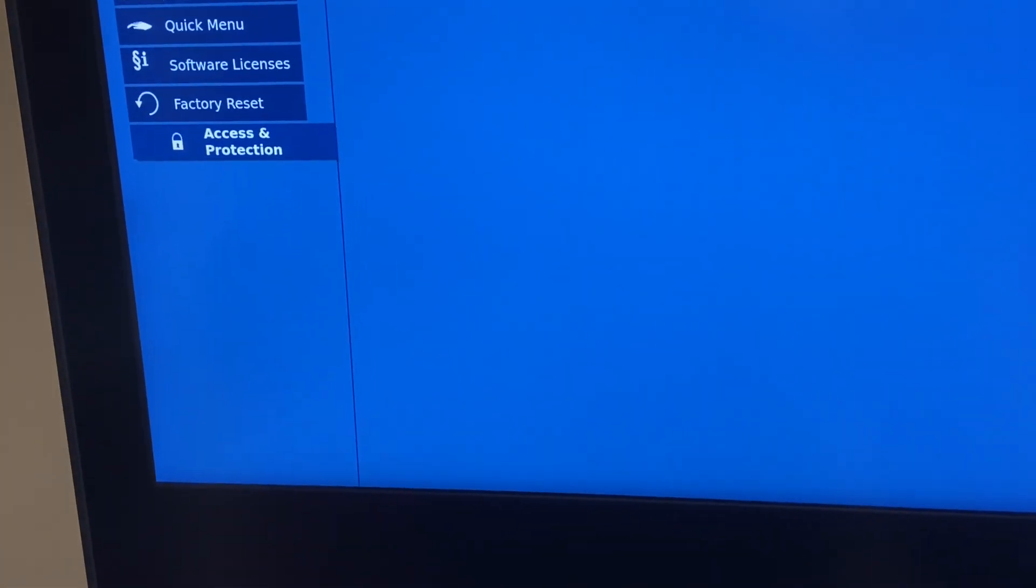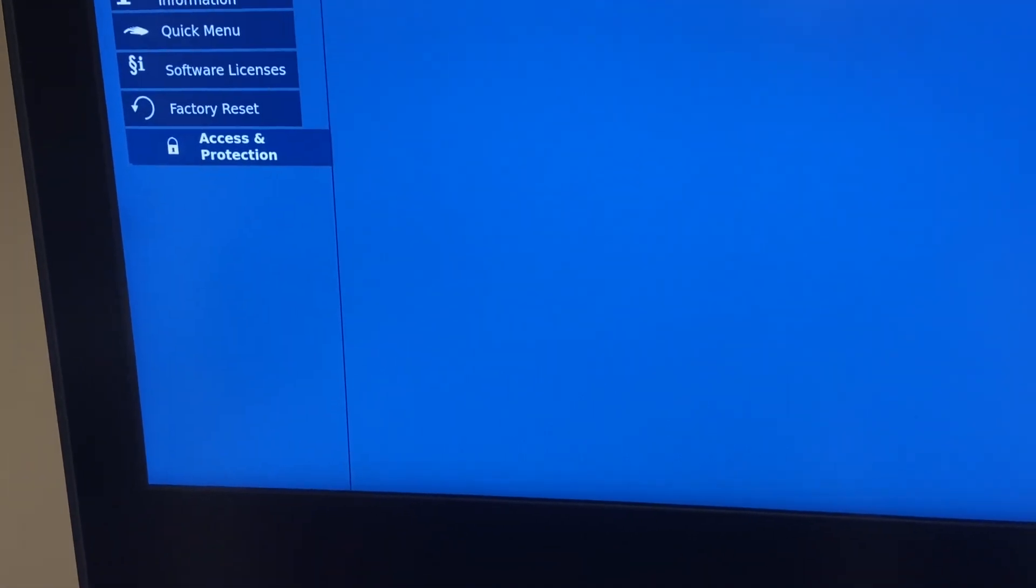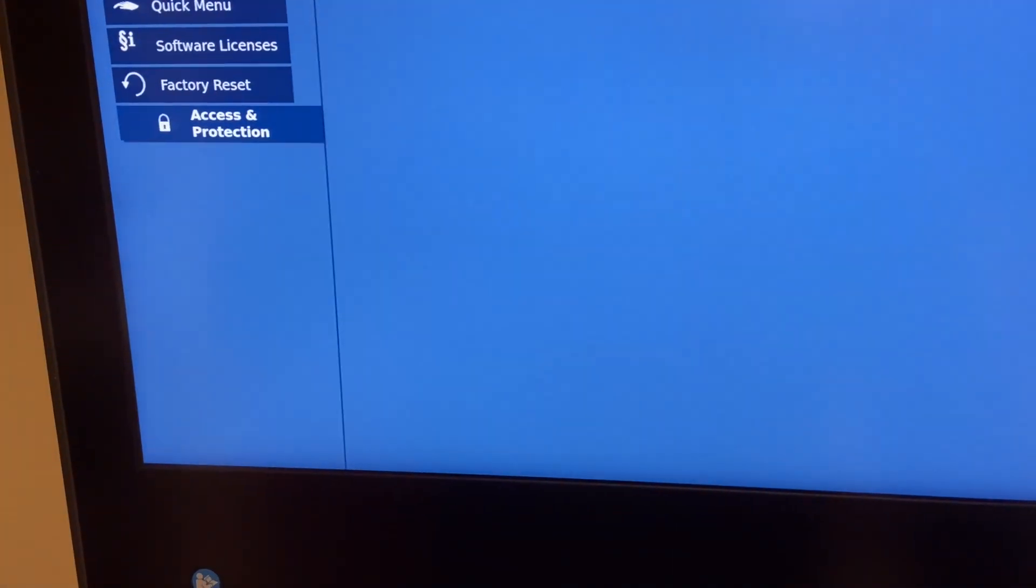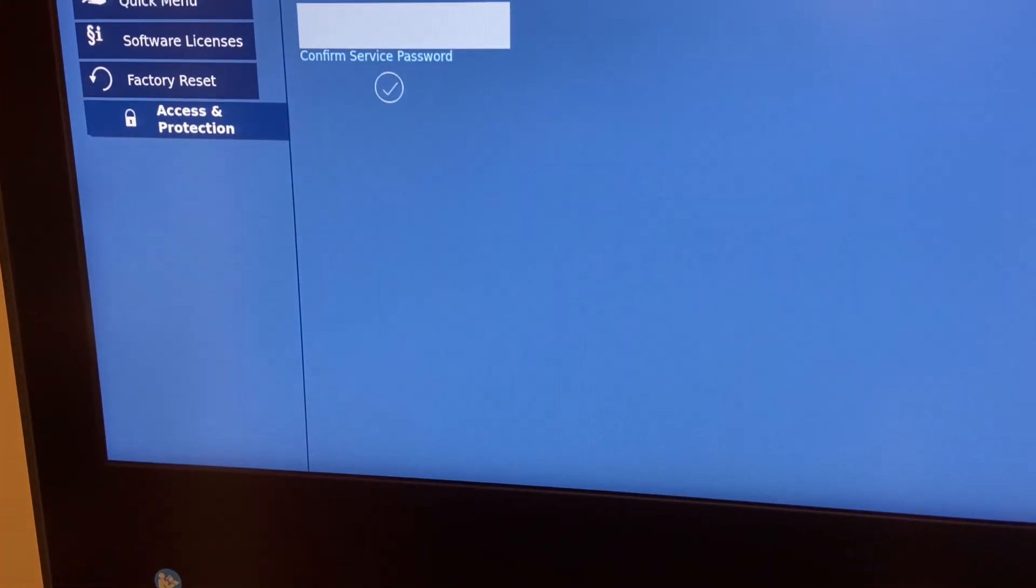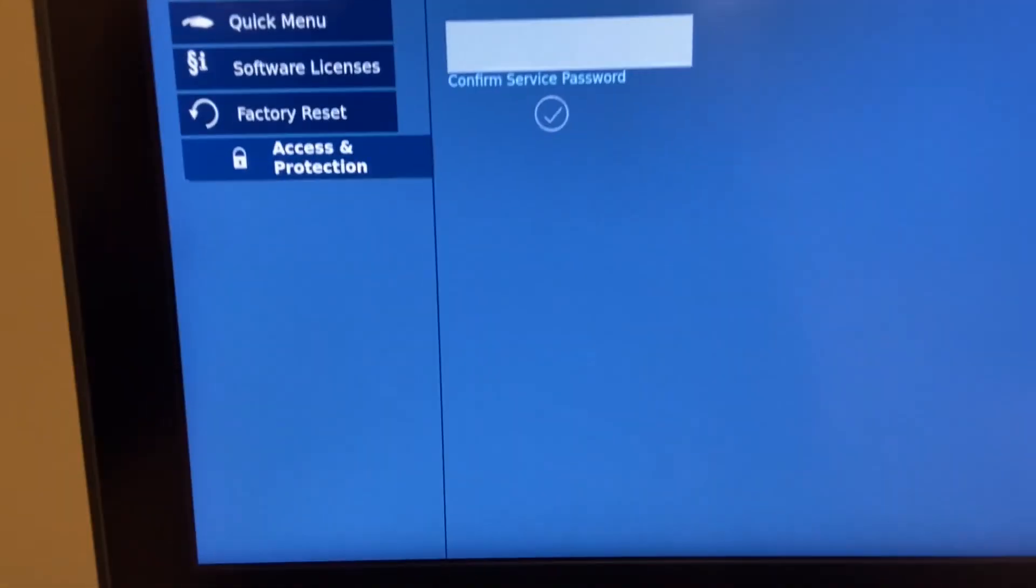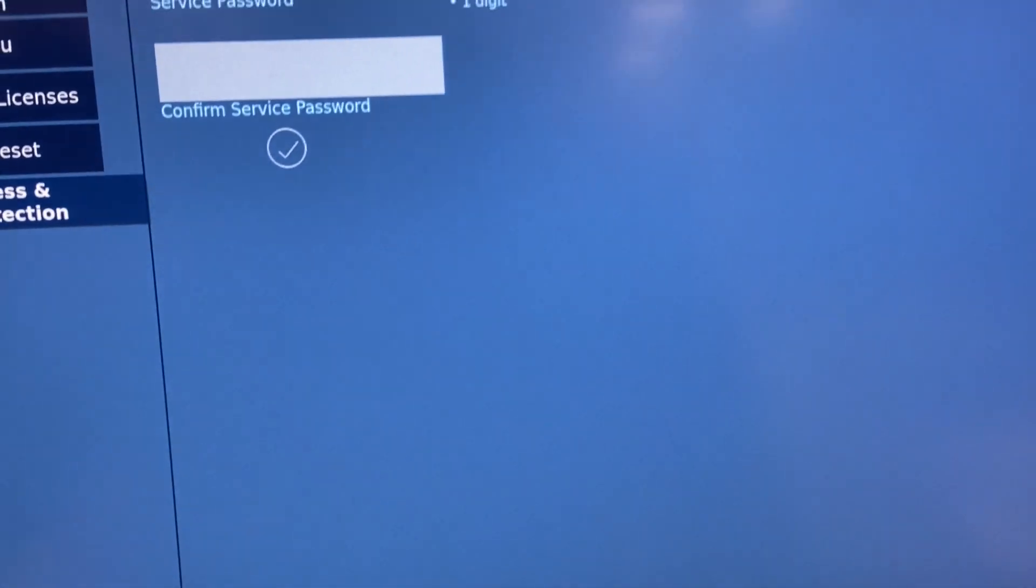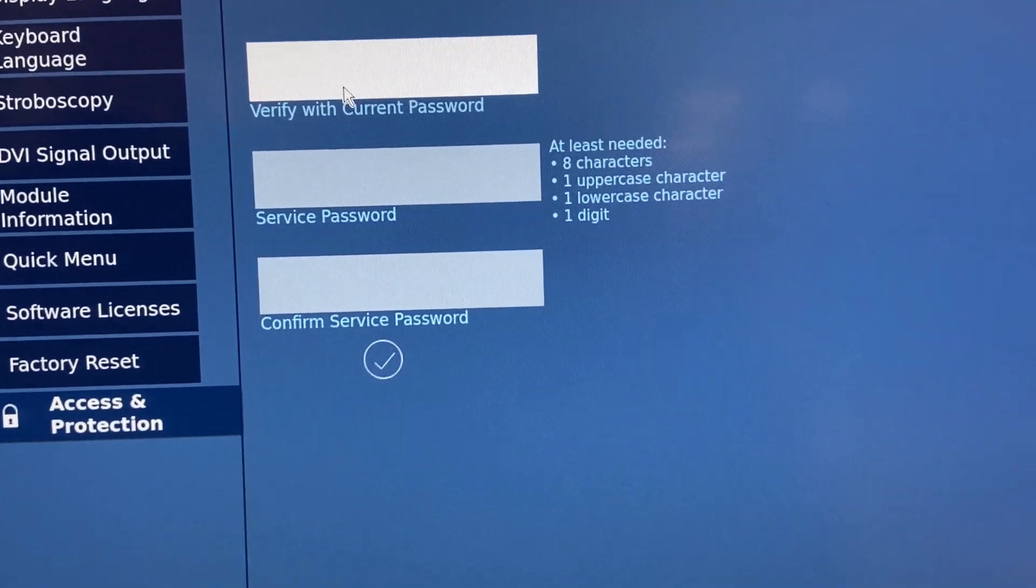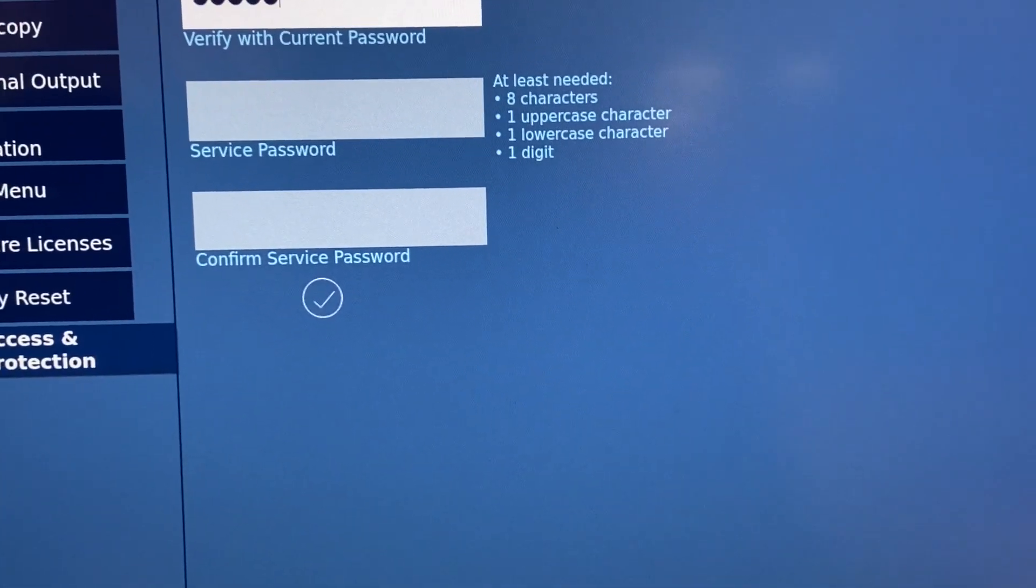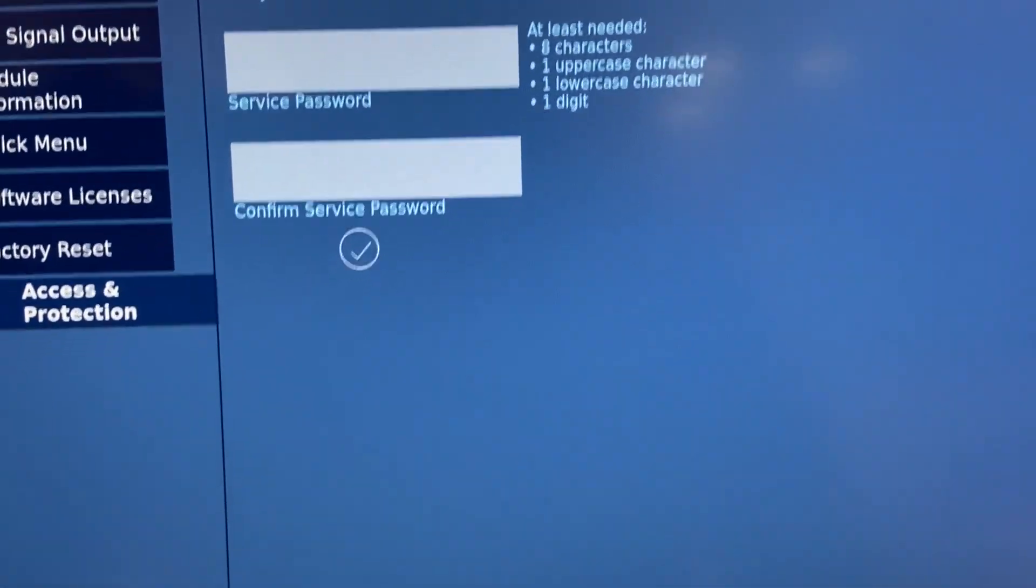Activate service passcode. Current passcode is 90290245.